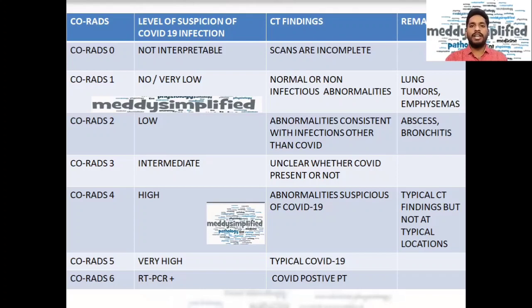CORADS 3 means the suspicion of having the infection is intermediate — in between. The CT findings are not clear as to whether COVID-19 infection is present or not. So it is labeled CORADS 3, intermediate.